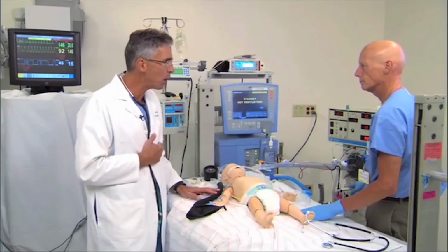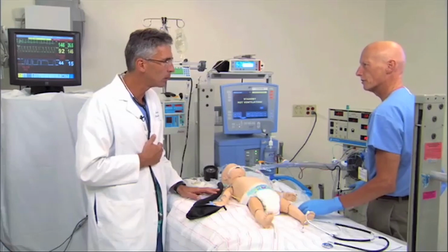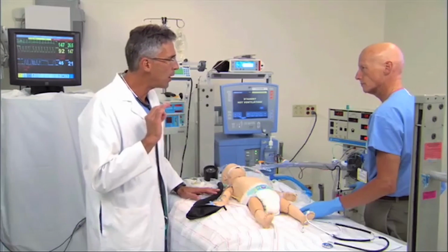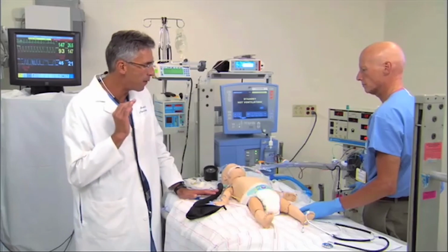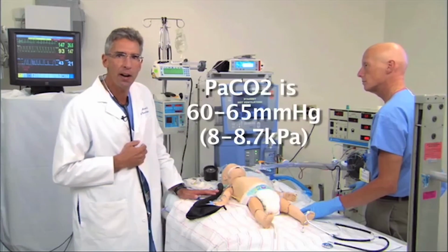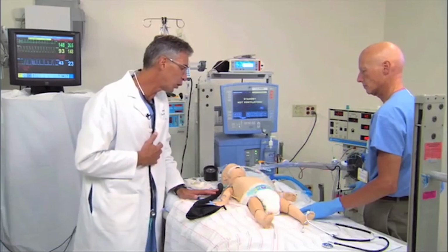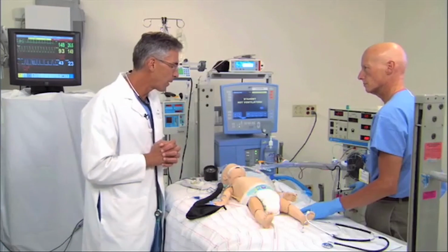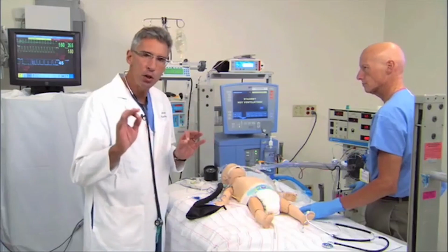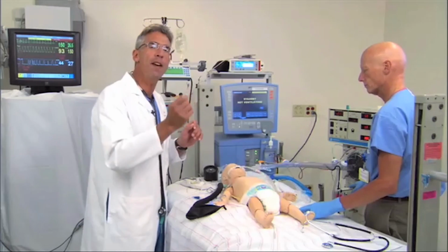So Barry, are you happy with where we are on the ventilator? I am, John. I would wait for the blood gases to come back and then fine-tune. Okay. Now the other thing that occasionally happens is that that first blood gas returns and the CO2 is 60 or 65. And you say, boy, that's a little too high for the moment.